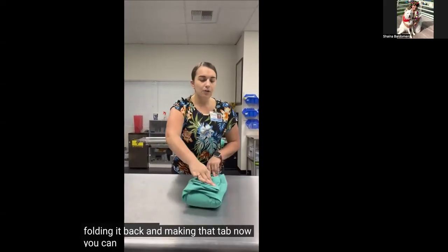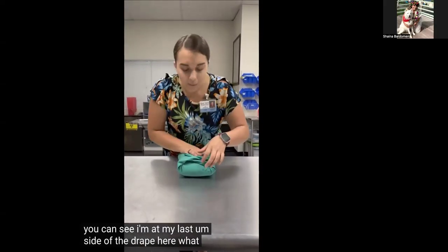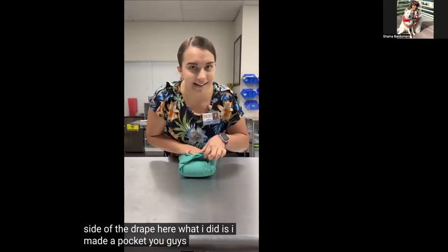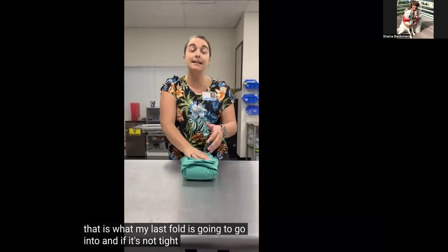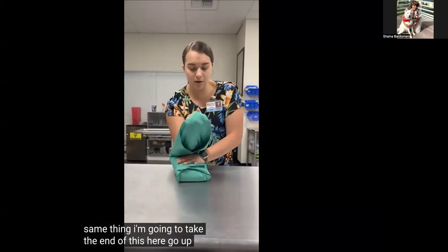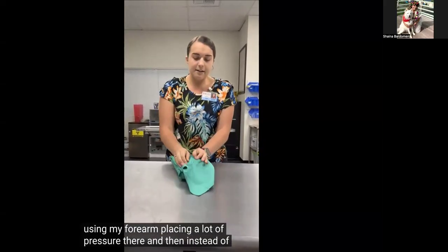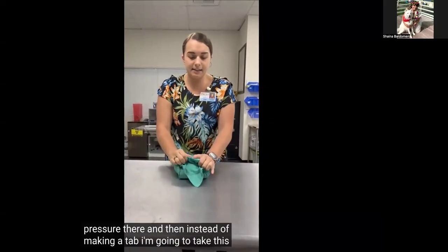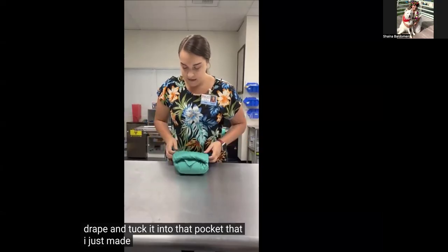Now you can see I'm at my last side of the drape here. What I did is I made a pocket, you guys. That is what my last fold is going to go into. And if it's not tight, it's not gonna hold. So same thing, I'm gonna take the end of this here, go up and over using my forearm, placing a lot of pressure there. And then instead of making a tab, I'm gonna take this drape and tuck it into that pocket that I just made.